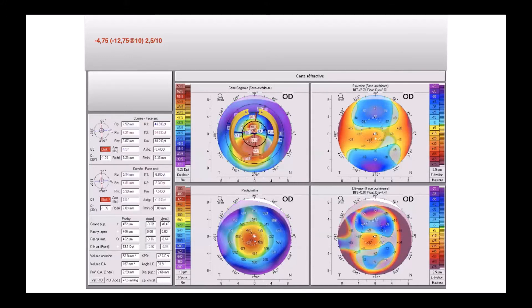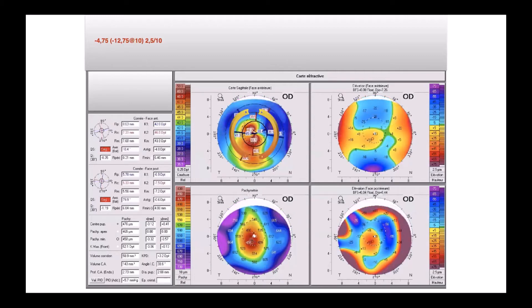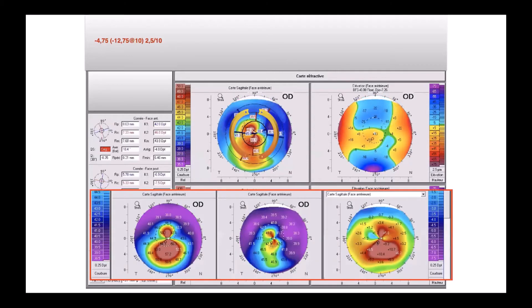Four months later, the result is very different. This is the differential map. As you see, we have a snowman-shaped differential map with a reduction of astigmatism — more than 10 diopters of difference. The astigmatism goes from minus 12 to minus three.